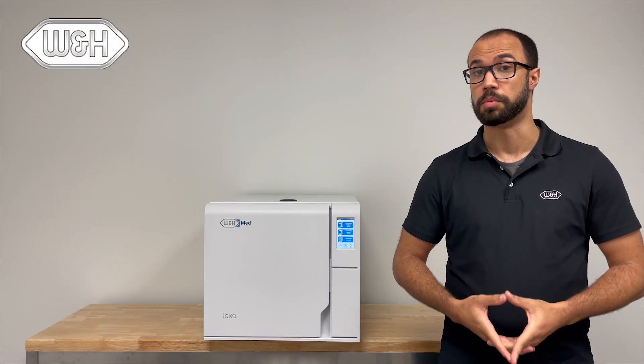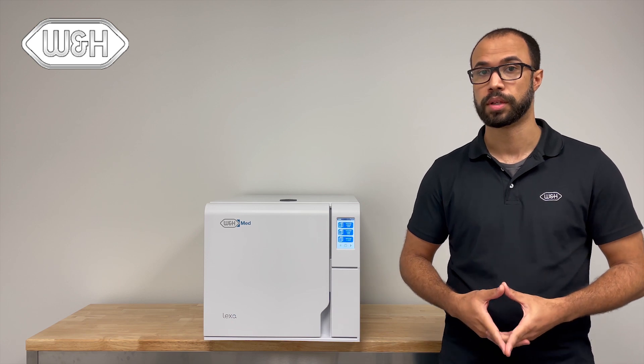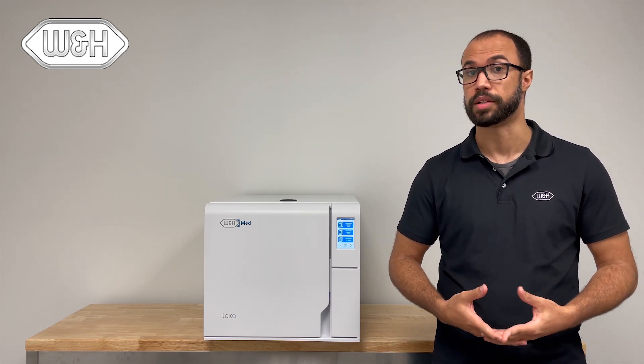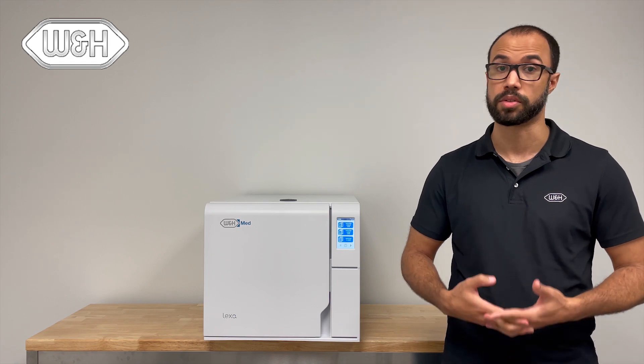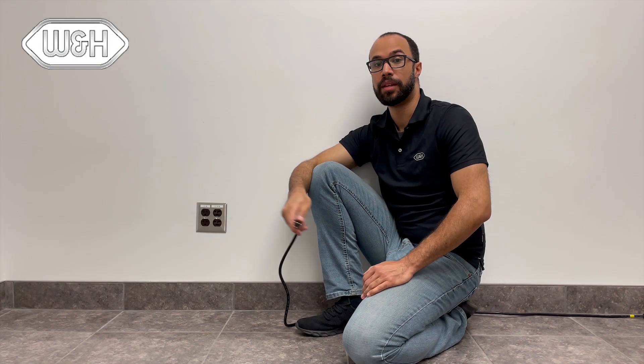The Lexa comes in two models: a 110-volt and a 220-volt. The 110-volt model requires a standard 110-volt outlet and either a 15-amp or 20-amp circuit. The 220-volt requires a standard 220-volt outlet and a 15-amp circuit. Regardless of what option you choose, the Lexa must be on its own dedicated circuit with no other equipment drawing power.